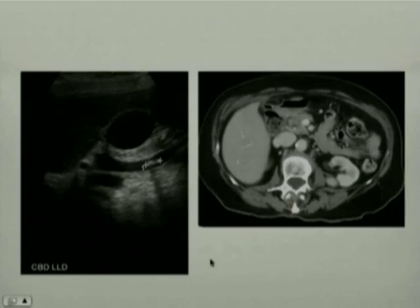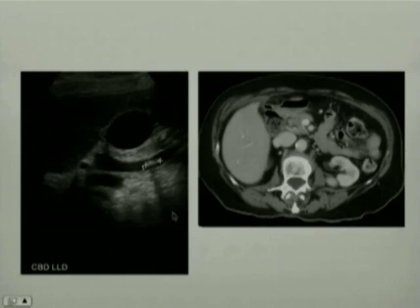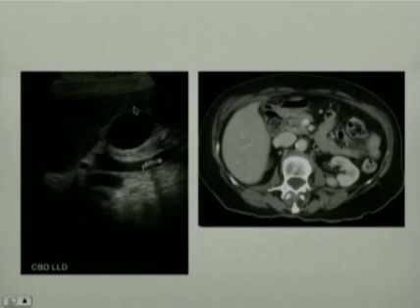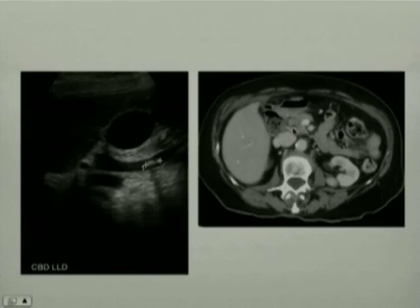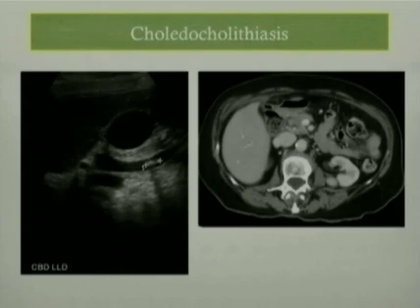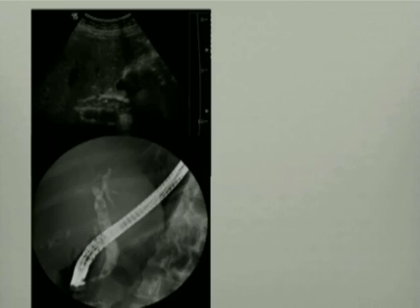Another cause of right upper quadrant pain related to the biliary tract is a bile duct stone. The sonographic picture demonstrates an enlarged dilated common bile duct and an echogenic focus within the distal common bile duct with posterior acoustic shadowing suggesting the presence of a stone. The gallbladder appears normal without evidence of wall thickening or gallstones. The CT picture also demonstrates very clearly the presence of stone within the common bile duct — the diagnosis was choledocholithiasis. Another example demonstrates a dilated common bile duct with multiple echogenic areas representing sludge and gallstones, confirmed on ERCP which shows a dilated common bile duct and multiple filling defects.